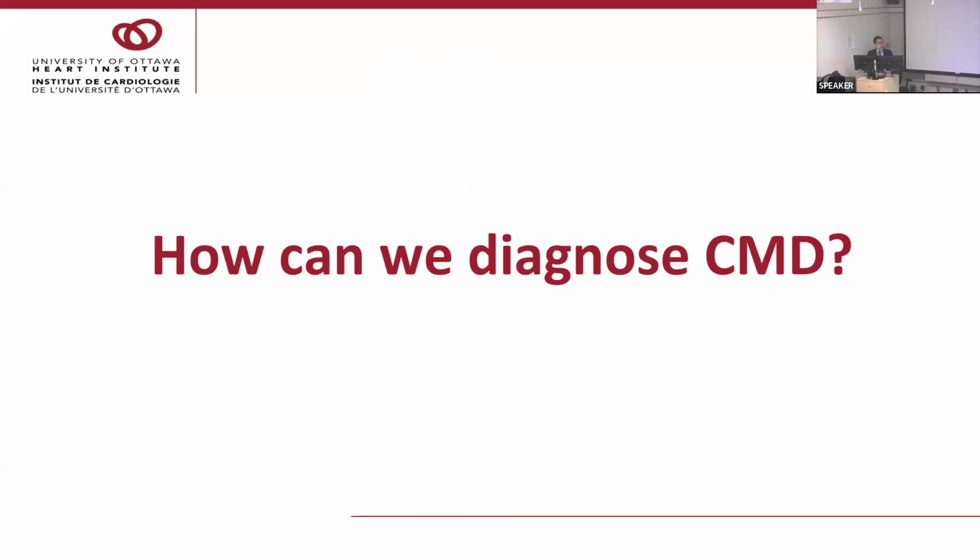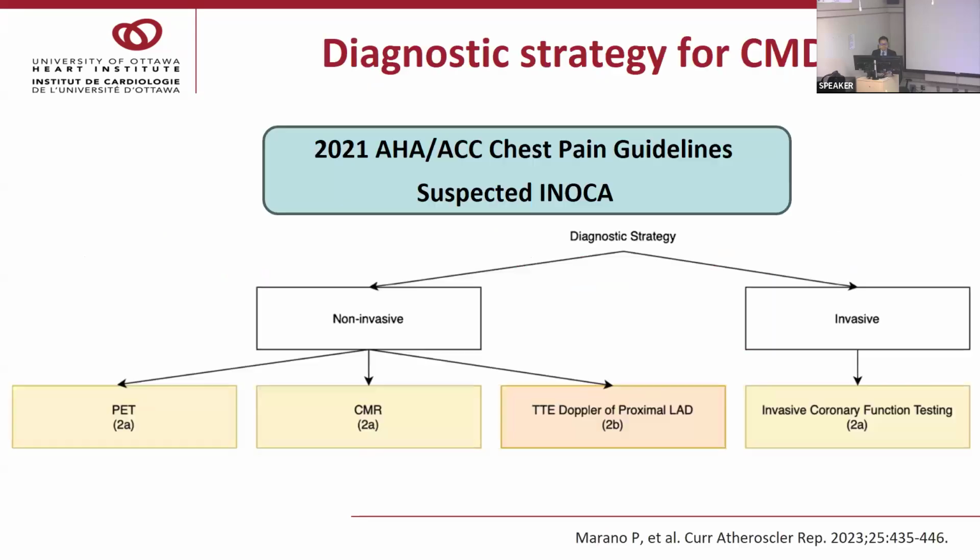All right, so now how can we diagnose CMD? Although there is no established diagnostic strategy for CMD, the 2021 AHA and ACC chest pain guidelines include a diagnostic strategy for INOCA. Looking at this, invasive coronary angiography with functional testing has a 2A recommendation. Similarly, PET and MRI have a class 2A recommendation, whereas TTE has a class 2B recommendation. So now let's walk through each modality.